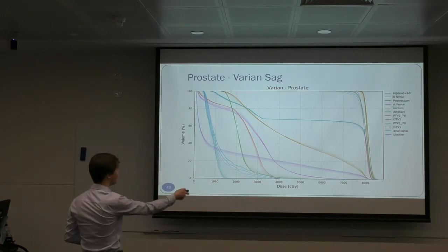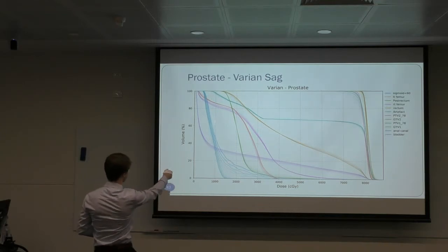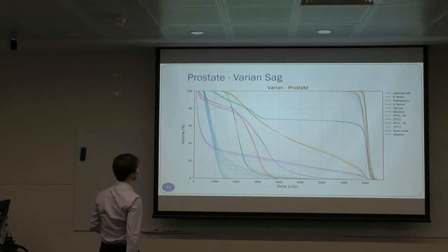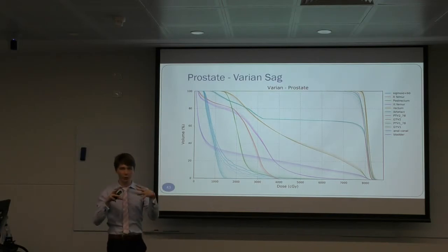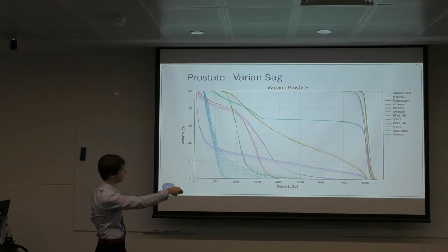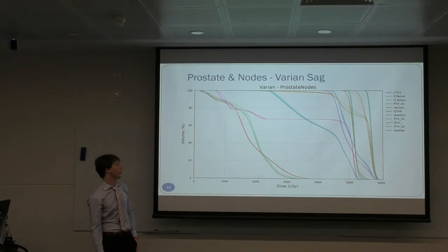So for this treatment site, for example, the sigmoid colon is actually getting better, because that's an organ at risk and you're getting lower dose. But for something like the right femoral head, you're getting higher dose. And probably the worst part about this one is the planning target volume, where you want a uniform dose, and a perfectly uniform dose just corresponds to a straight line, dropping off to 0. So you're getting a decrease in uniformity. And I did similar things for the other two plans.